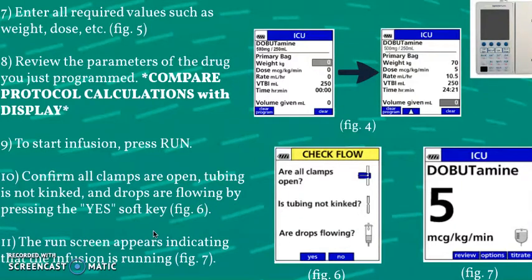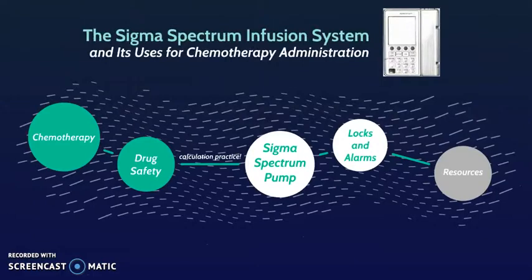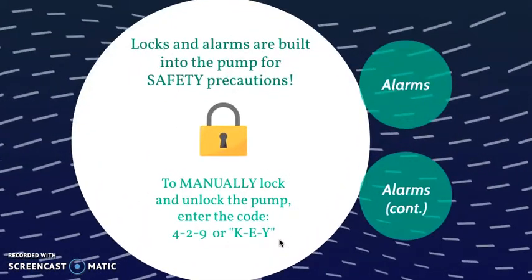The run screen will appear indicating that the infusion is running. It's pretty straightforward — a lot of it is just following the prompts on the screen. In this last section, I did want to add some information about the built-in lock system and alarm, so you have a more well-rounded idea of the pump system.